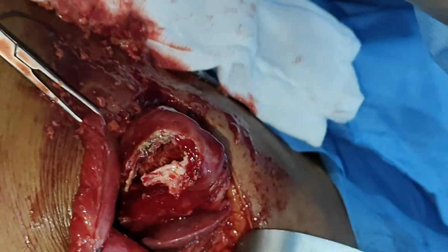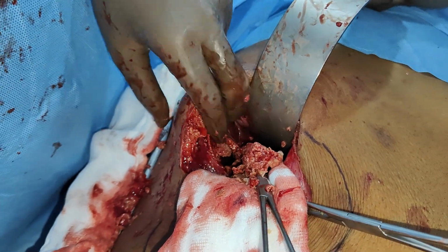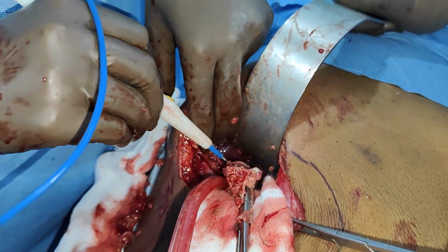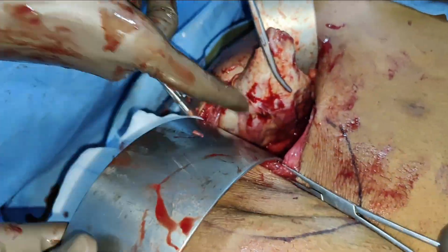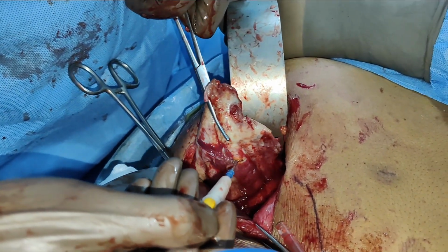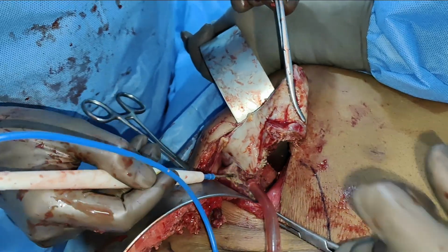So once this was done, the inferior aspect of the cyst wall was also pulled up and it was cut. Because of the long-standing infection, it had become a thick-walled cyst, and you can notice the pus or the thick flakes around the cyst wall which were there. All the cyst wall was completely removed and wide deroofing was attained. This is the inferior border of the cyst, the white cyst and the red liver exactly at the margin. We started doing the deroofing complete. Now we are coming towards the lateral aspect of the cyst and the complete deroofing was attained.